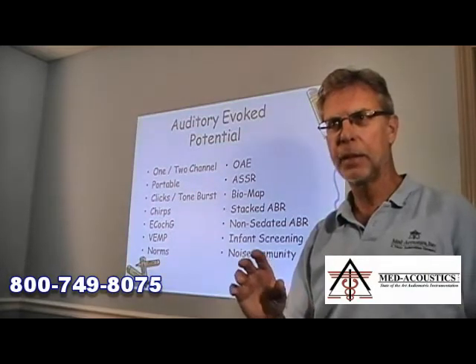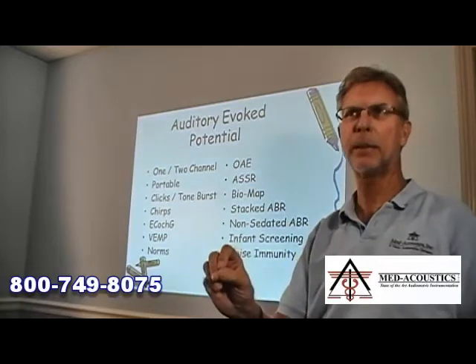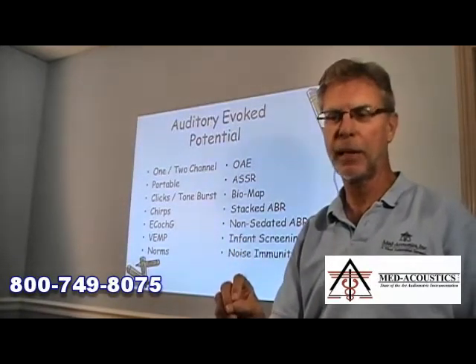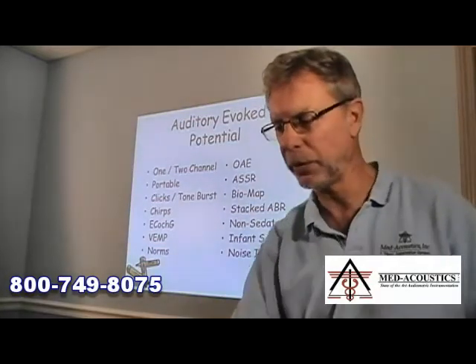And over the years of experimenting with every system known to man, I've come to realize that the front-end design, in other words, the design of the preamp, is the all-important thing. And some are way more noise immune than others. So that's an important thing too.